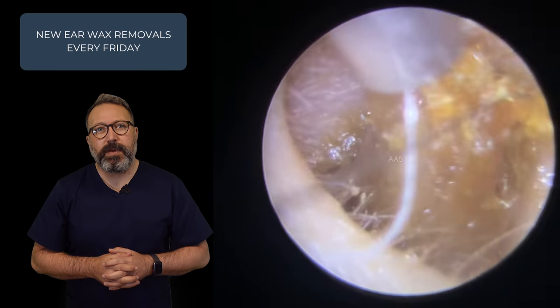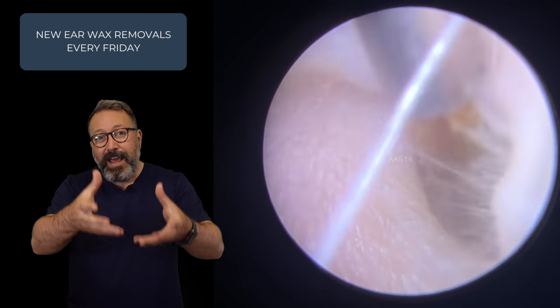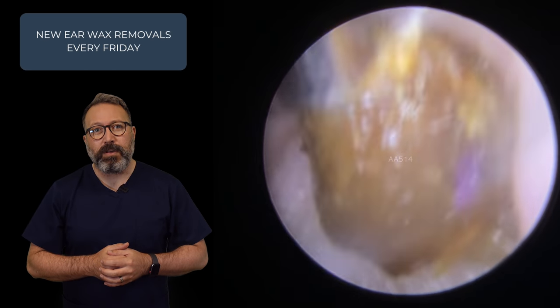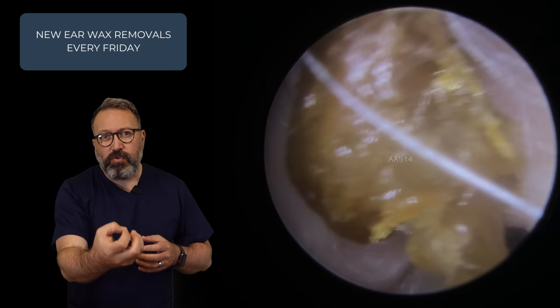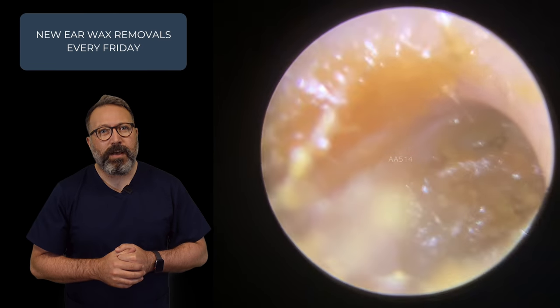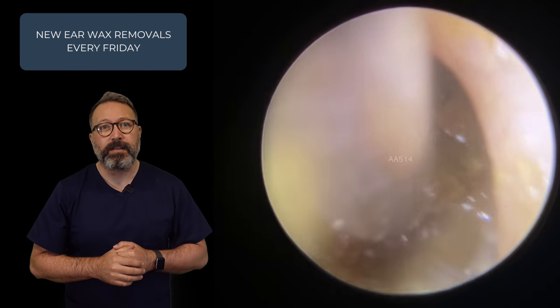We've got a nice piece just coming out of the canal. You can see it almost leapt forwards with the suction. I've slowed everything down so you can see this coming away. There we go — a nice big piece with a little dry skin tail to it as it comes away. And we'll take a look behind there — there's another big chunky bit of wax in there, so we'll go and grab that now.